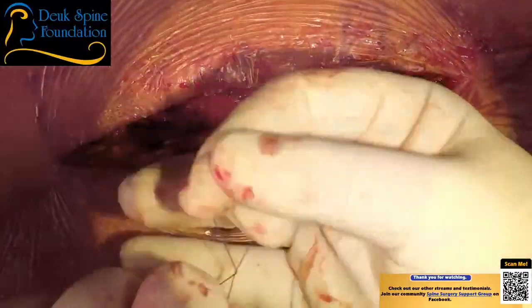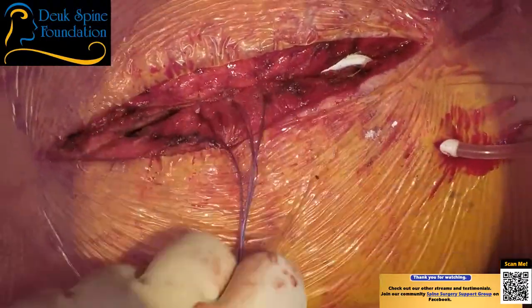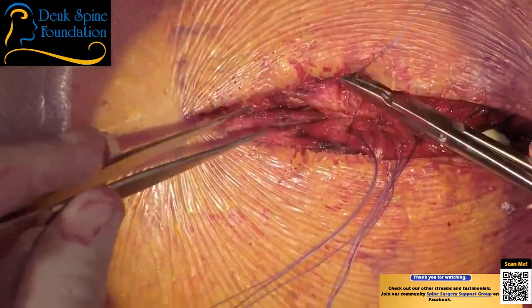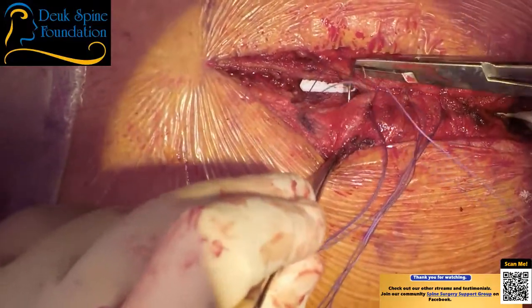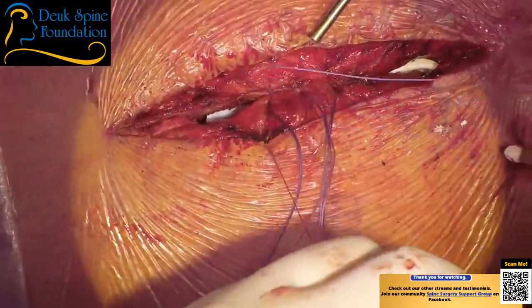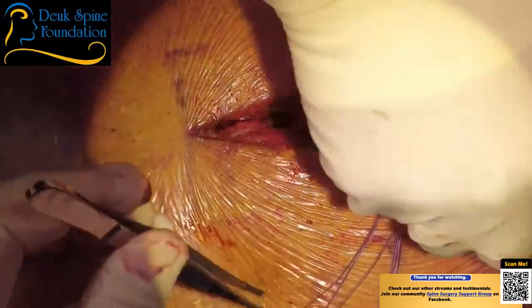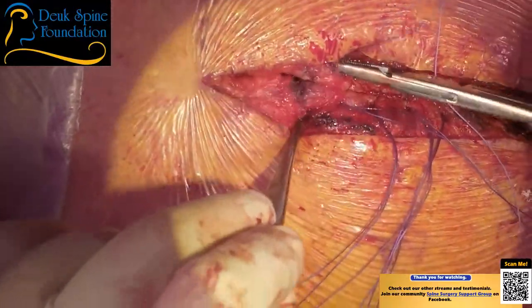Not the suction. So these surgeries that we broadcast are live, meaning that when we have issues, you get to be part of it. And as a surgeon, I don't like having things deviate from the normal, because I figured everything out over the years, exactly how to do everything perfect. I can't do it myself. I rely on my teammates. But they have to do their job right. Otherwise, we start having issues, like right now with some bleeding, blood pressure must be kept below 110. And not with a sedative, with an antihypertensive, so that we can wake our patient up.